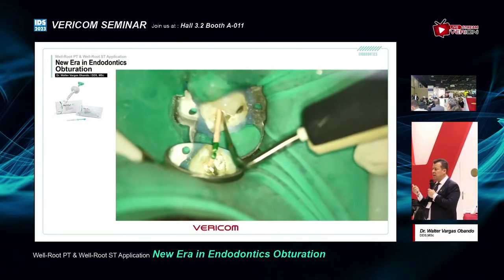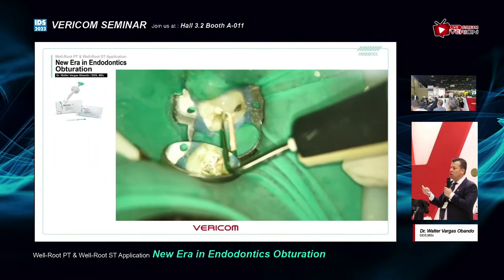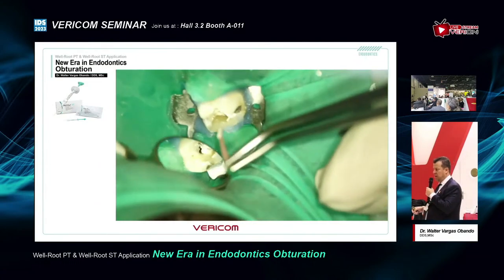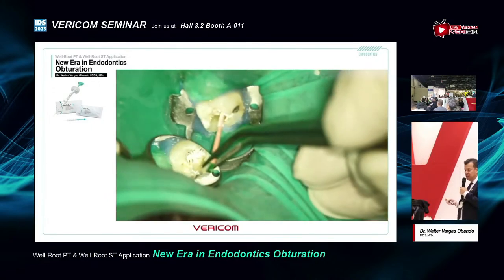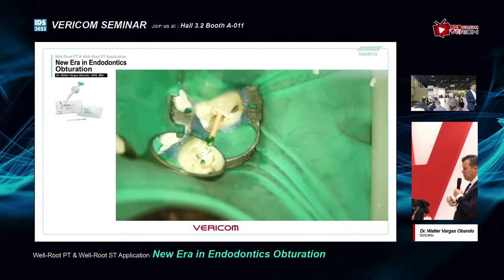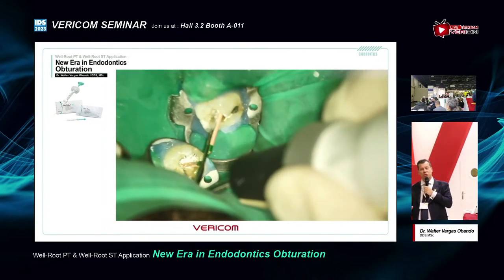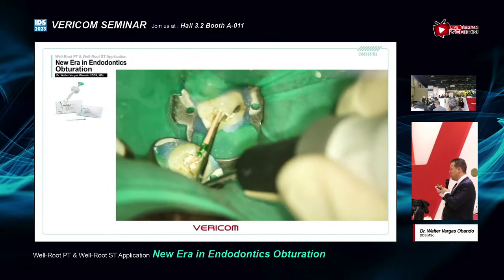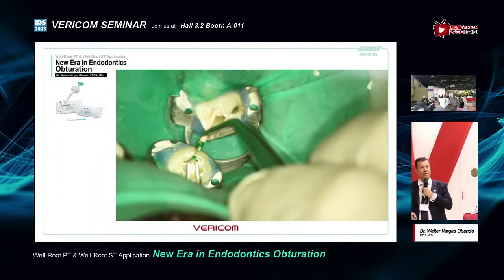And it's a good idea to reapply the bioceramic sealer twice, because you are going to have a better coat of the entire wall of the root canal. If you are using a microscope, you can see how well you fill the entire space of the root canal. And again, you don't need to go too deep inside of the canal, because you don't need to overheat the bioceramic cement. Then you remove the excess.